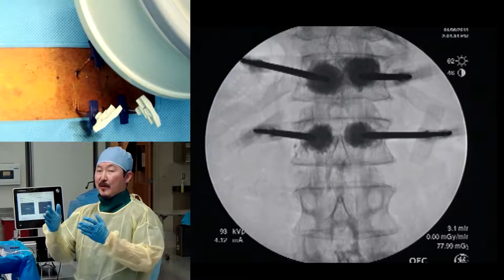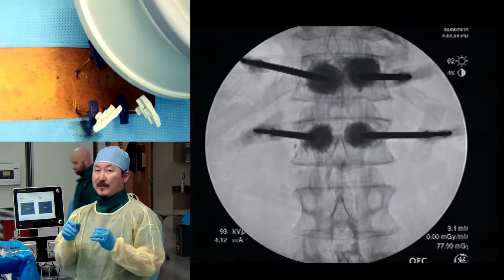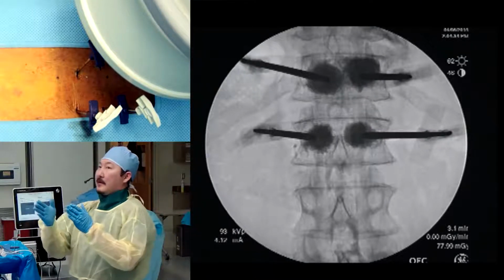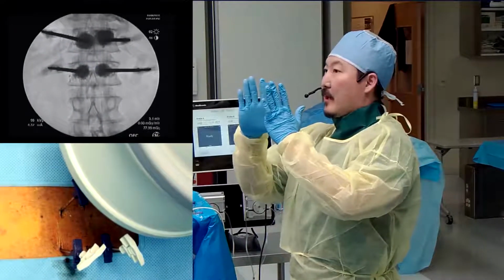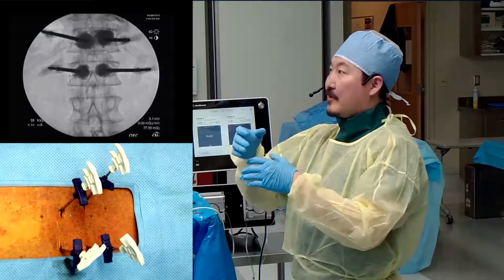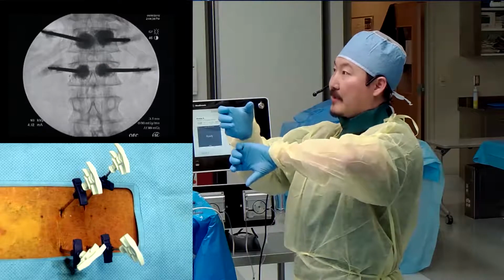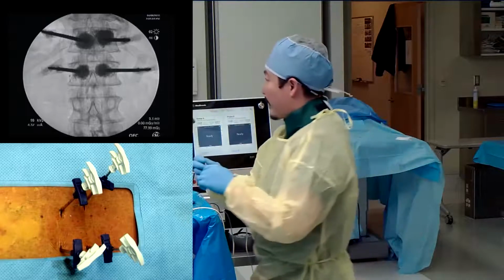And you can play around with the starting point of your trocar, which will dictate how it fits and how it's able to maneuver within the pedicle. The way you can think about that is, the pedicle is kind of like a nuclear reactor shape, right? So there's an isthmus right in the center. If you stack up multiple cylinders, in the isthmus it actually gets very narrow. On the outside, it's almost like having two trumpets on opposite ends of each other. So if you want to get to the tumor, it might be better if I try to illustrate it here.